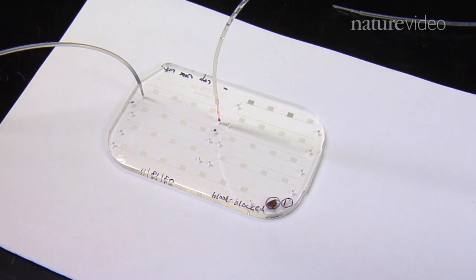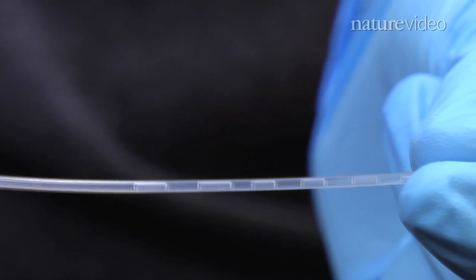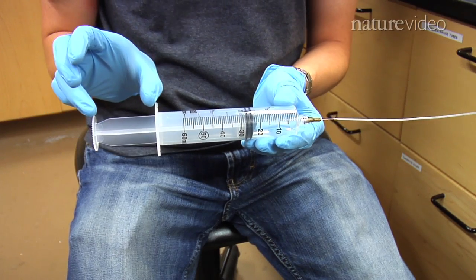To keep costs low, the M-CHIP was designed with only three simple parts: a plastic tube loaded with blood and chemical reagents, a molded plastic card lined with microchannels, and a syringe that pulls the blood and reagents through the device.